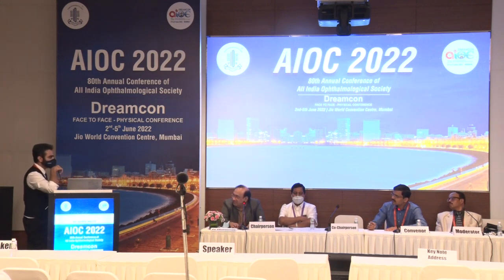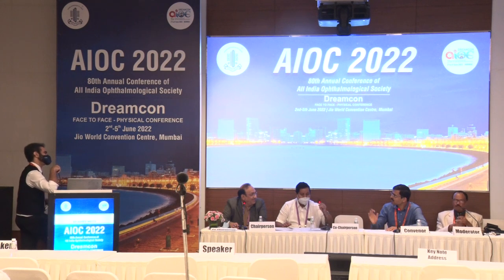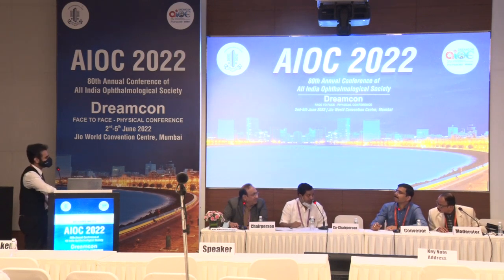It is extremely difficult over a long time. If you go home today and ask one of the fellows or trainees you're training, after a whole day of seeing through the side viewing, how's your neck and back, just that one question is more than enough. All the answers come in. I'm a standalone practitioner, so I don't have that, but I would seriously like Dr. Paul, because he trains a lot of people. We can call and ask, sir, how does it compare? You must have had loads of trainees. Do you think trainees enjoy and see better than with your observer scope?